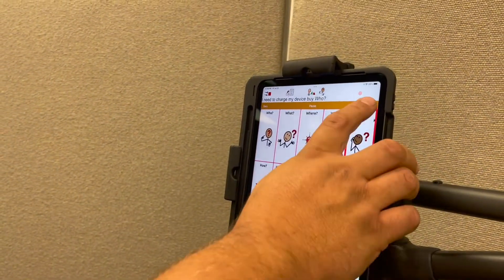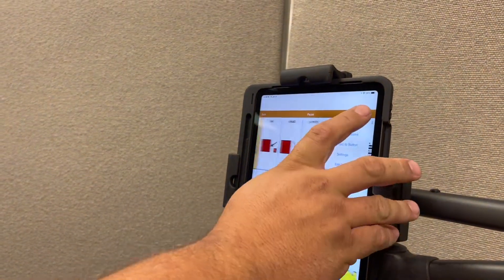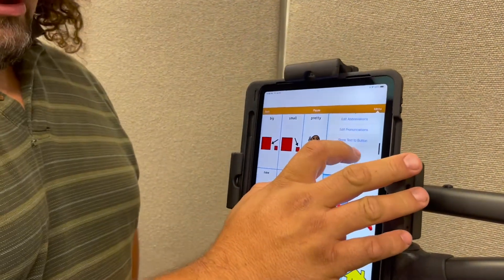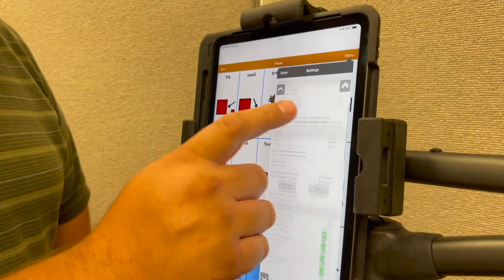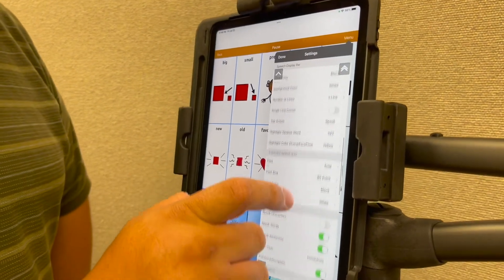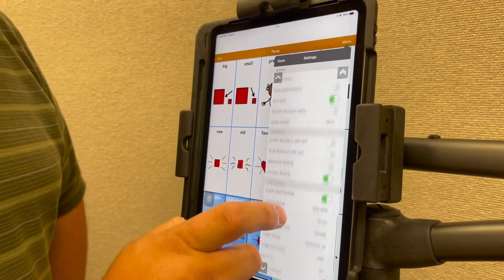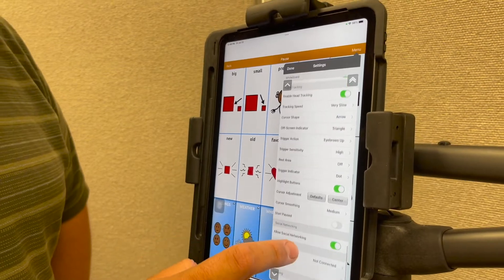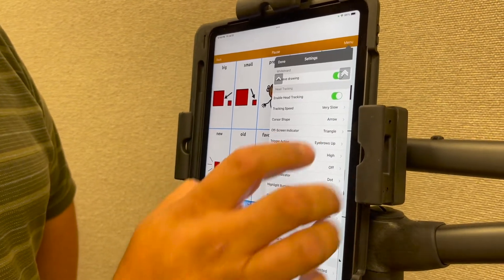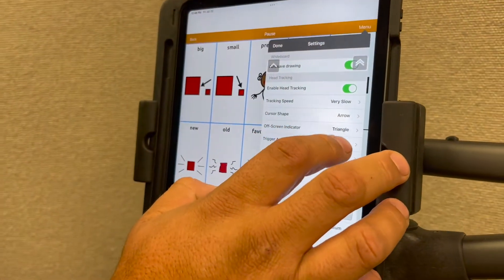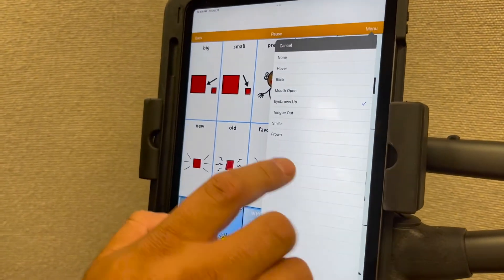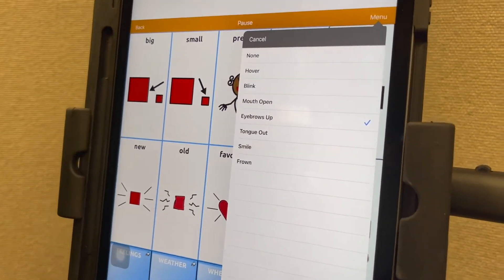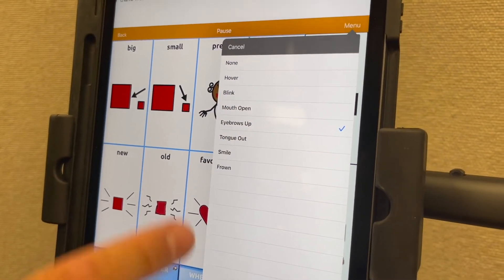Some of the other options for activation on this — I'll go in here and we'll look at the settings. We can change the activation of how we're doing that with our head. Currently we have it set up with eyebrows up, but we can do it with a hover, blink, mouth open, tongue out, or smile.